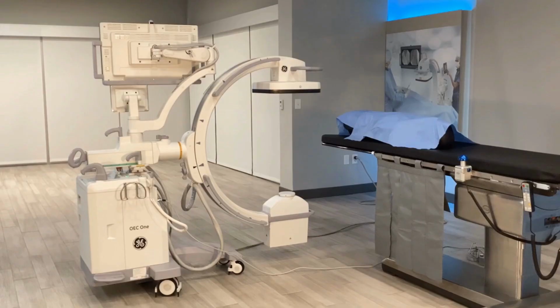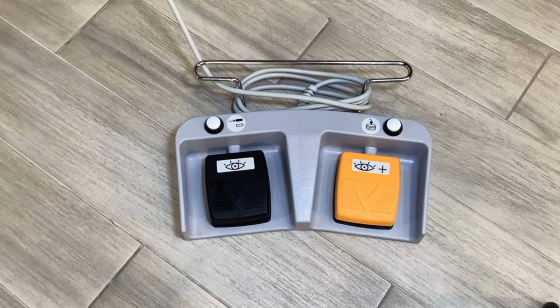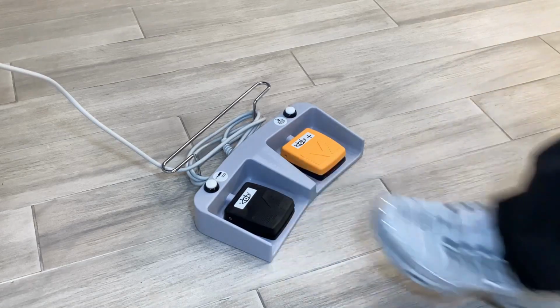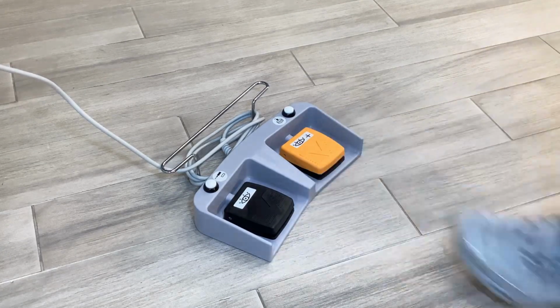In this video, we will review how to use the OEC1 CFD Footswitch and Handswitch. The Footswitch. Press the left black button labeled with the eyeball to produce normal fluoroscopic images. Press the right yellow button labeled Eyeball Plus to produce high-level fluoro or digital spot images.